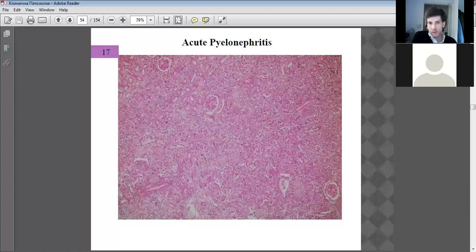I can still see, however, in this condition, some normal tubules, fairly normal. No holes, good cellular structure, good luminal conformation. There's some normal ones there. It's more around this collapsed one here that we see loss of some of the tubules. Not really much necrosis, maybe one or two spots of it up here, but not a lot.